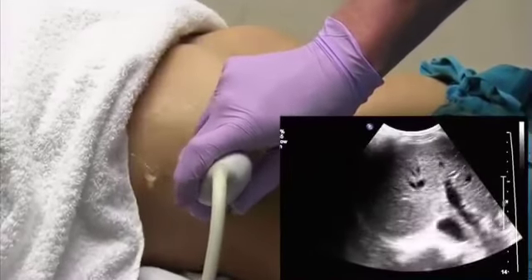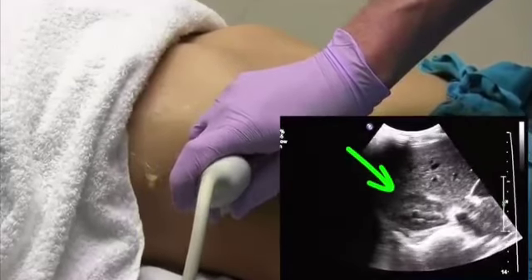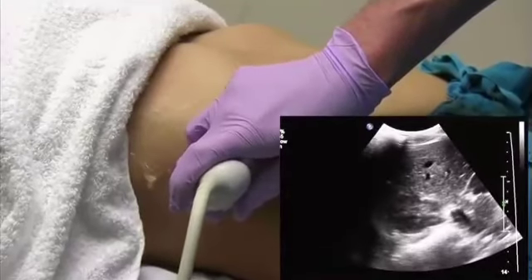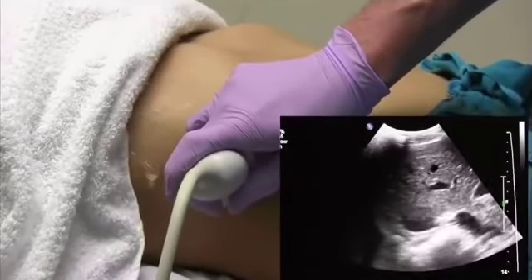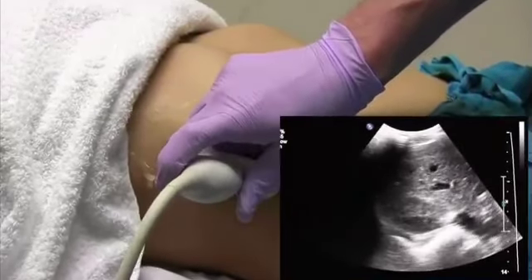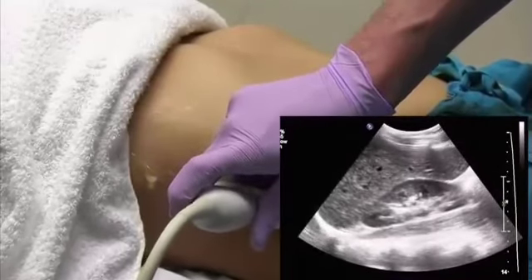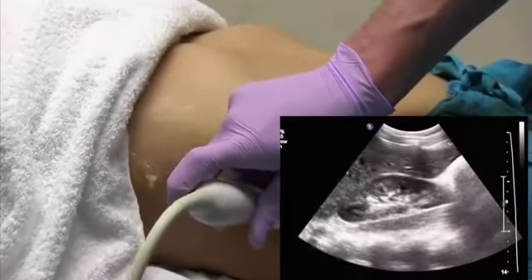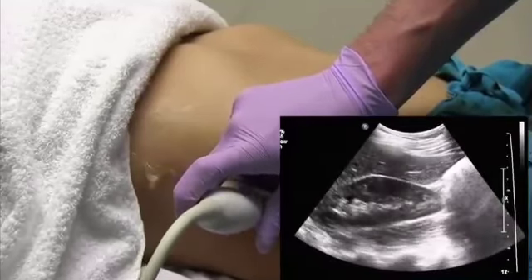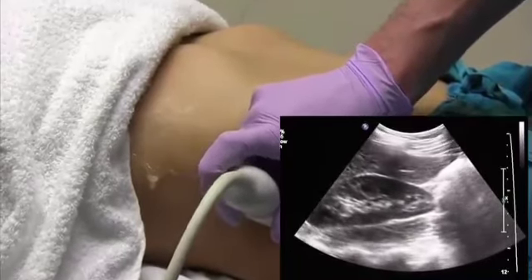At the last rib space, you should start to see the upper pole of the kidney against the liver surface. From here you can kind of judge the echogenicity of the liver and the kidney, and then as you turn coronal, you'll be able to evaluate if there's any liver enlargement. The right kidney and the liver tip should both end at about the same spot.